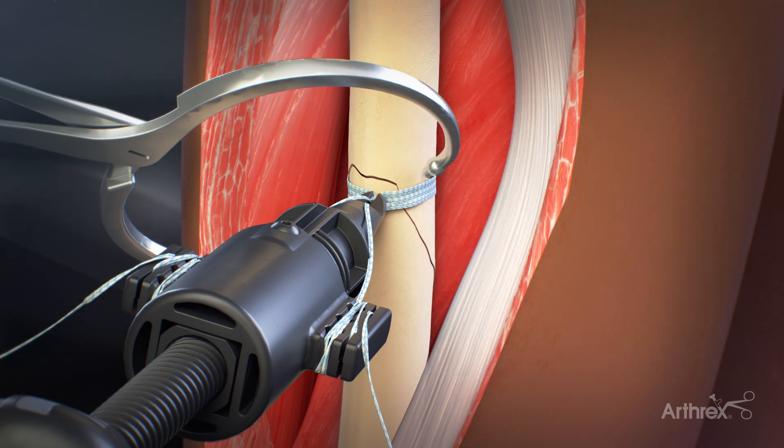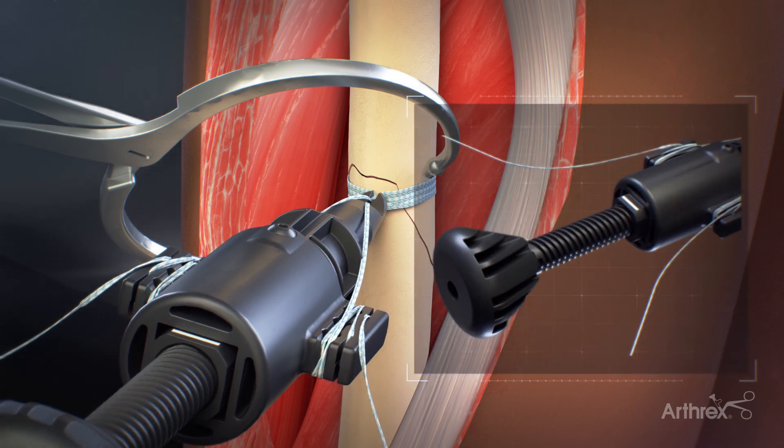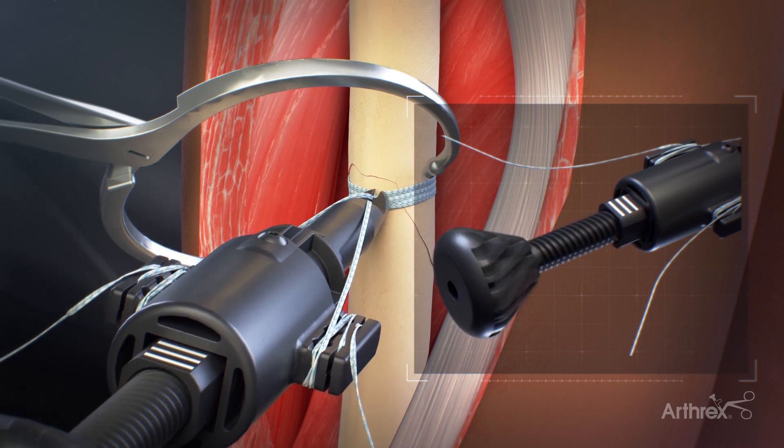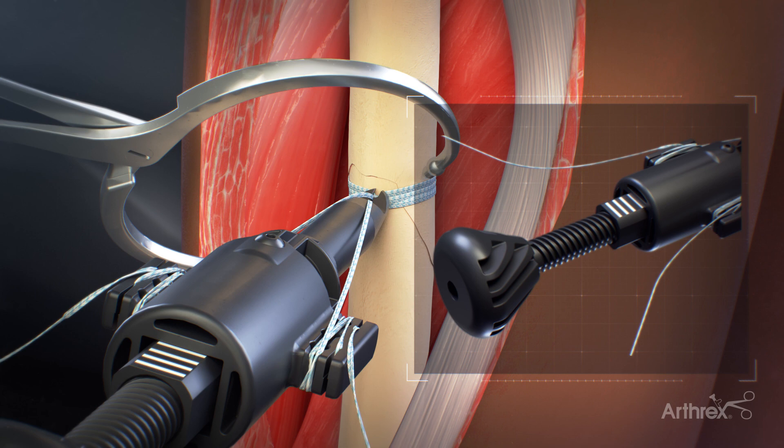Repeat this step for the second suture tail. Begin tensioning the fiber tape by turning the handle clockwise. As tension is created, notice the gauge lines on the back of the tensioner. Continue to apply the necessary amount of tension, making sure not to over-tension. Watch the gauge lines on the back of the tensioner and do not tension beyond the fourth line.